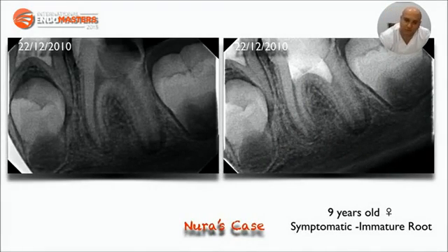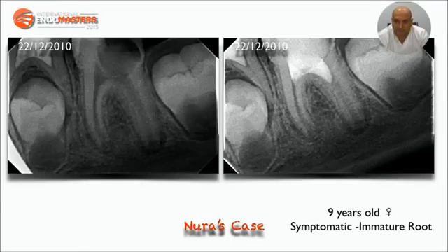But what happens in cases of developing permanent teeth with more extensive pulp tissue inflammation, like Noura's case that was referred to my practice back in 2010? MTA partial pulpotomy here seems inadequate to deal with the extensive pulp tissue destruction, and although total pulpectomy or extraction were alternative treatment approaches, full pulpotomy sometimes could prevent extraction in cases like this. Full MTA pulpotomy in cases of immature permanent teeth.